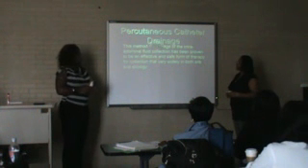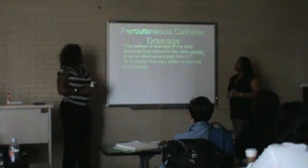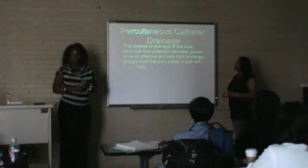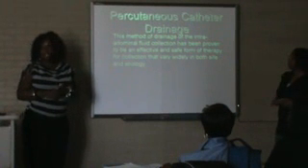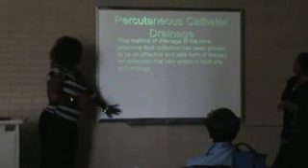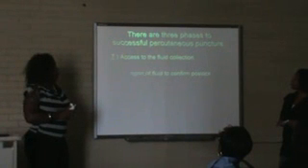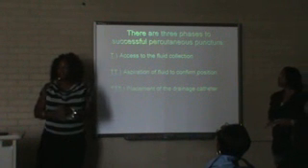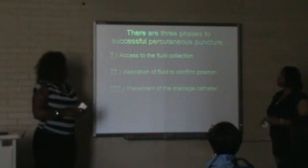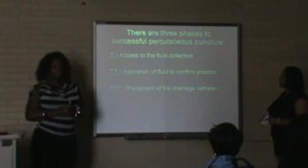Percutaneous catheter drainage. This method of drainage of intra-abdominal fluid collections has been proven an effective and safe form of therapy for collections that vary widely in etiology and in site. There are 3 different phases for successful percutaneous puncture. The first will be access to the fluid collection. The second will be aspiration of the fluid to confirm the position. And the third will be the placement of the drainage catheter.